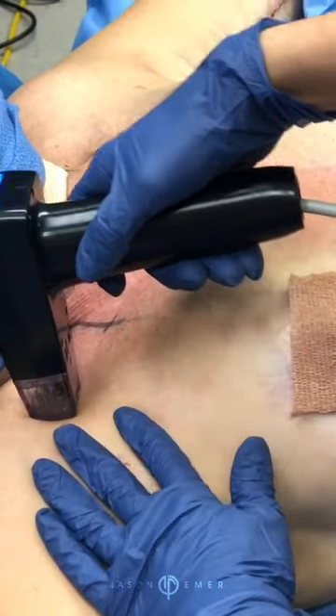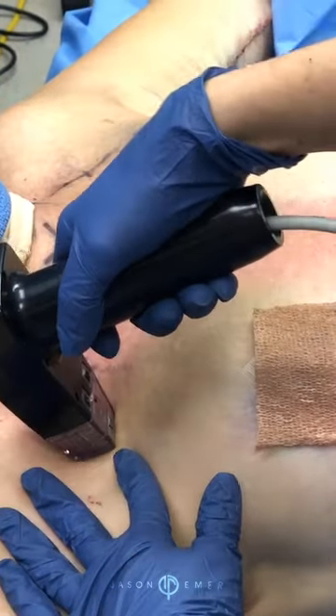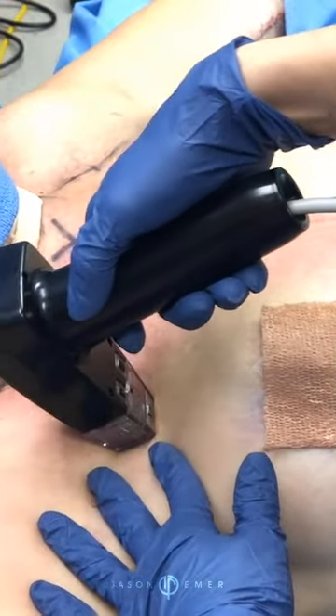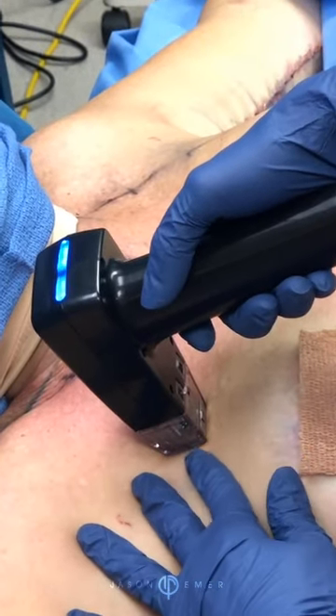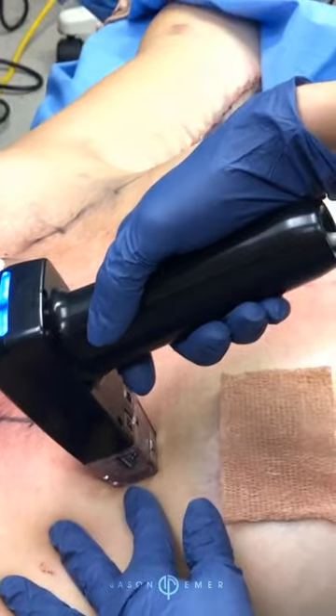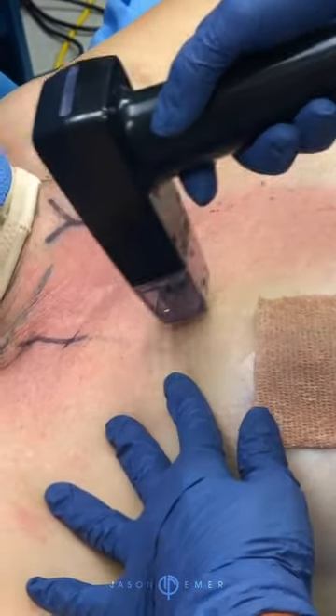Patients do very well with it and they're super happy. This is a great treatment to combine with others, whether it's IPL for pigment or surgical. It treats scarring, lines, wrinkles, acne — you name it.